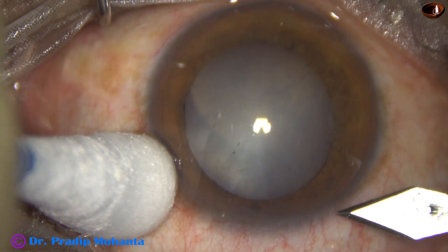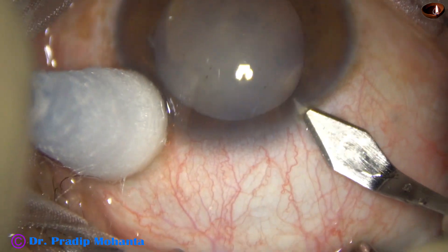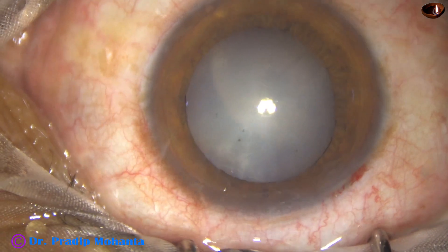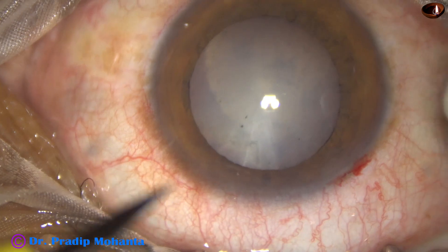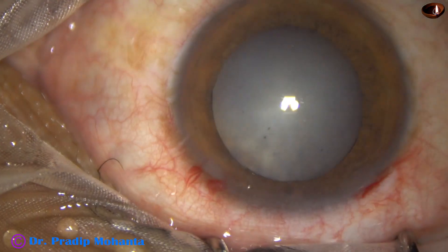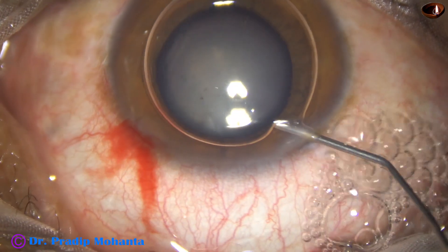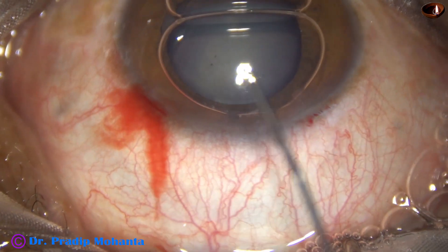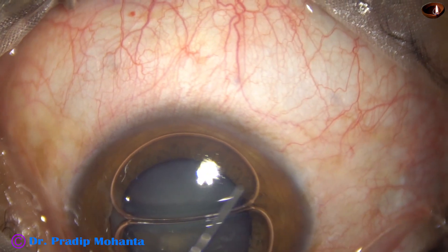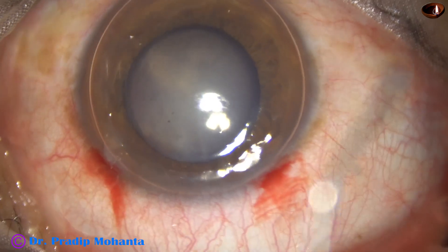The patient is a 32-year-old male. The patient underwent retinal detachment surgery and silicon oil was used for tamponade. The patient has developed this cataract, and the silicon oil is still there.